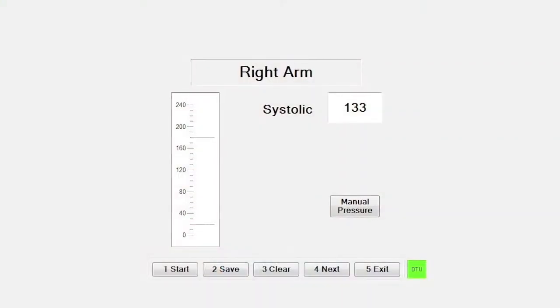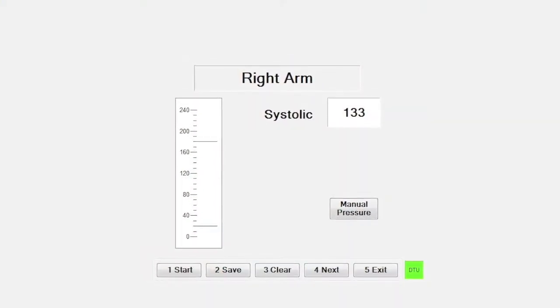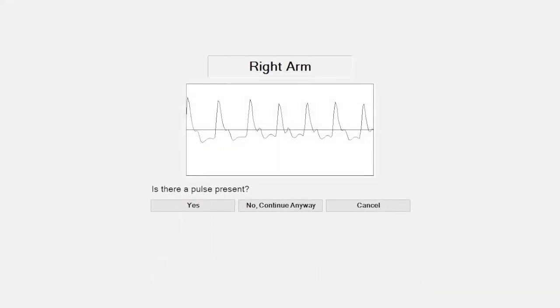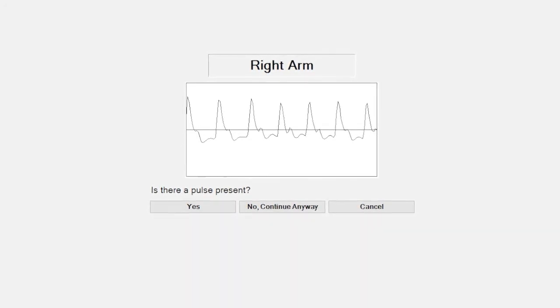Click the Start button on the screen or press 1 on the laptop keyboard. For arm pressures, the system will first display a reading from the PPG probe on the right finger and ask you to confirm a pulse.